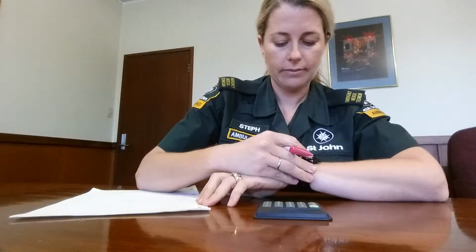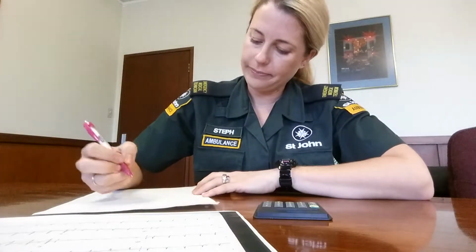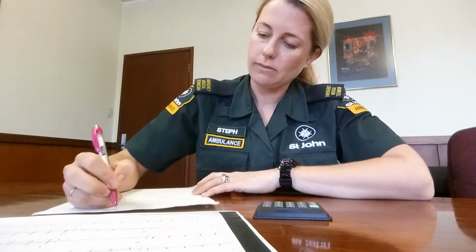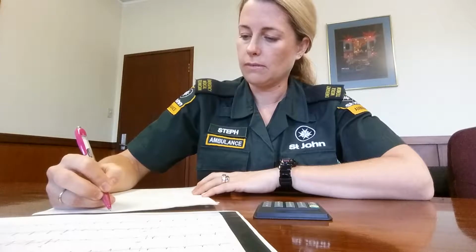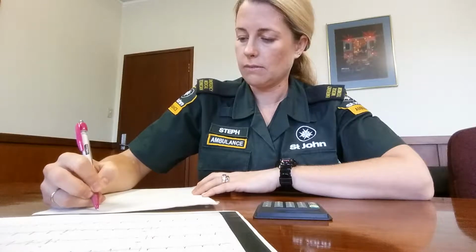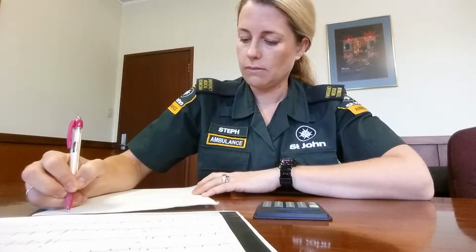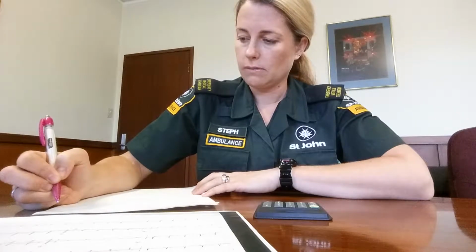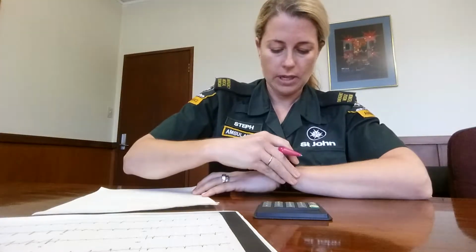I'm going to hand you an ECG, if you could read out the number of it, which is on the bottom. Number 4. And I'm just going to give you a short history. I have a 56-year-old male playing tennis. He developed sudden central chest pain and vomited. Conscious collapse, witnessed, non-injury. An opponent called the ambulance. The patient is pale and sweaty. He'd been playing for 20 minutes and he has 7 out of 10 chest pain. Start your assessment. Okay, starting now.